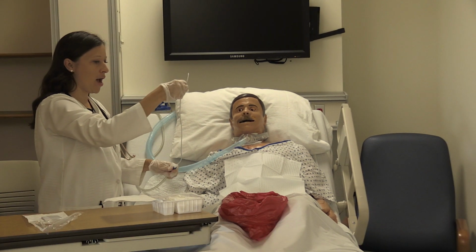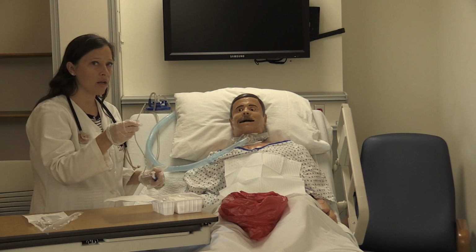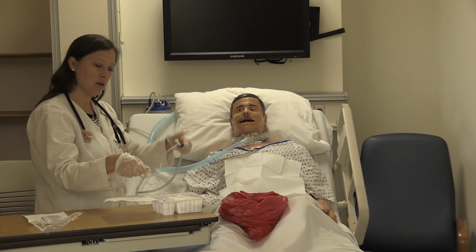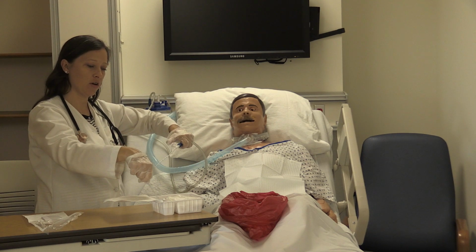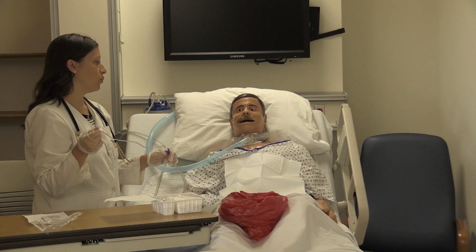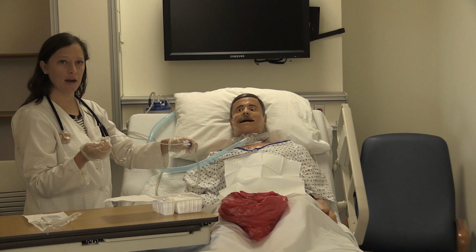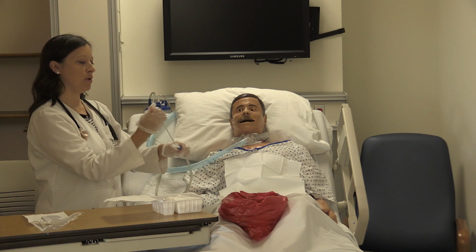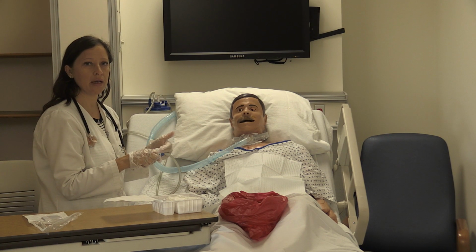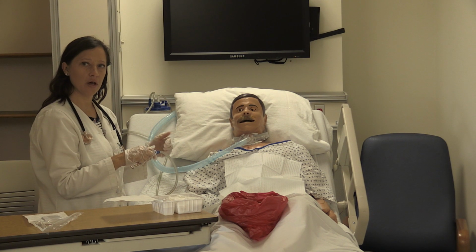Reapply his oxygen, hyperoxygenate him, clean the catheter. What you don't want to do is this. You don't want to let your catheter hang down low like this. You always want to make sure that this part is very, very sterile. So you want to clean the suction tubing out, and now we're going to go ahead and disconnect so that we can focus on the trach care part. So you're going to wrap the tubing up. One thing you don't want to do either is suction too many times that you start to get bloody tinged secretions out, because you don't want to cause any harm to the lung tissue.